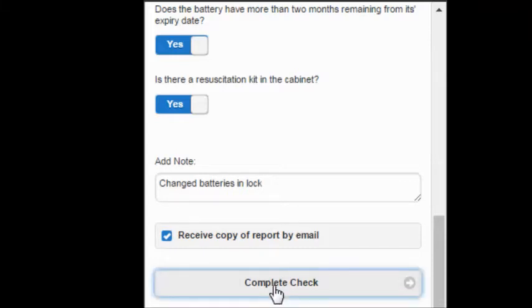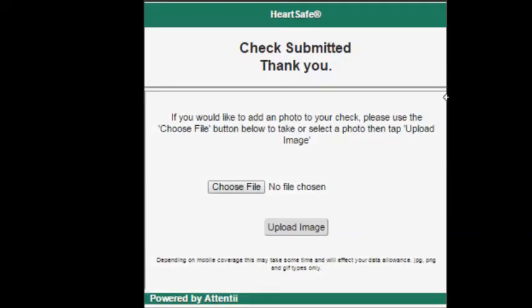Once you've completed the checklist and added any notes, you can complete your check by clicking the button below. When you submit your report you'll get a confirmation. If you'd like to send a photograph of your cabinet, hit the choose file button and either select a photograph from the library or take a photograph on your device. Then hit the upload image button — it may take a few seconds depending on your data connection, but we will receive it attached to your report.